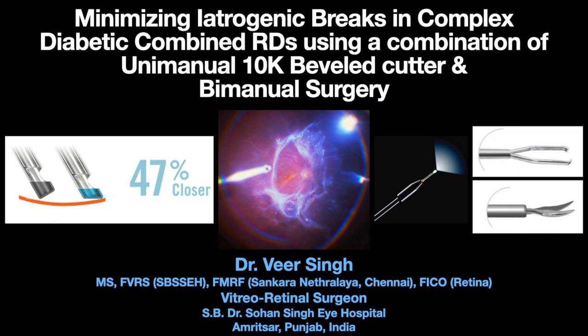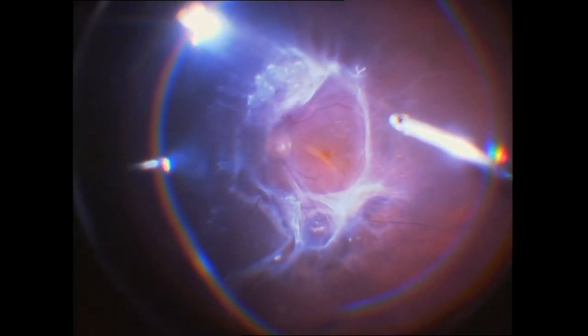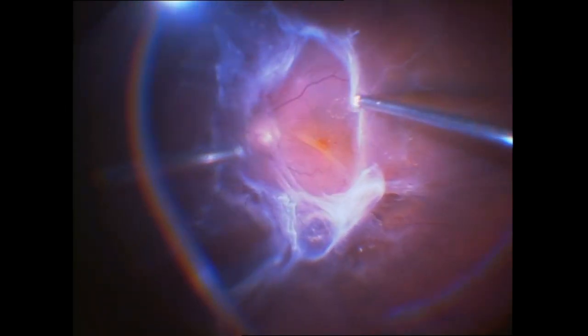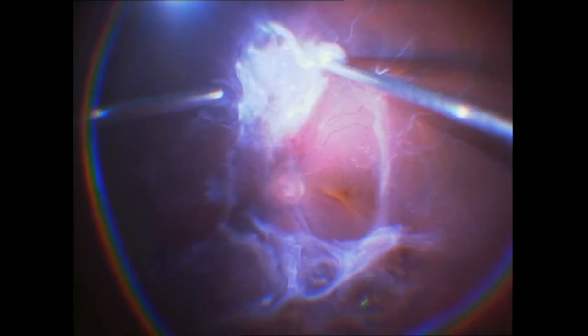The case is started by trying to segment the membranes by using the cutter itself. As the retina is not so mobile in the beginning of the case, it's fairly easy to segment and remove these membranes just with the cutter.